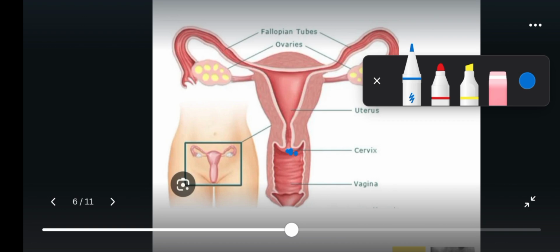At this point, the patient feels pain, and there could be mild bleeding. Now hold the anterior lip so that we can have easy access into the cervix. The cannula is then introduced into the cervix. If we are using a catheter, we use the catheter introducer to introduce the catheter through this opening into the womb.